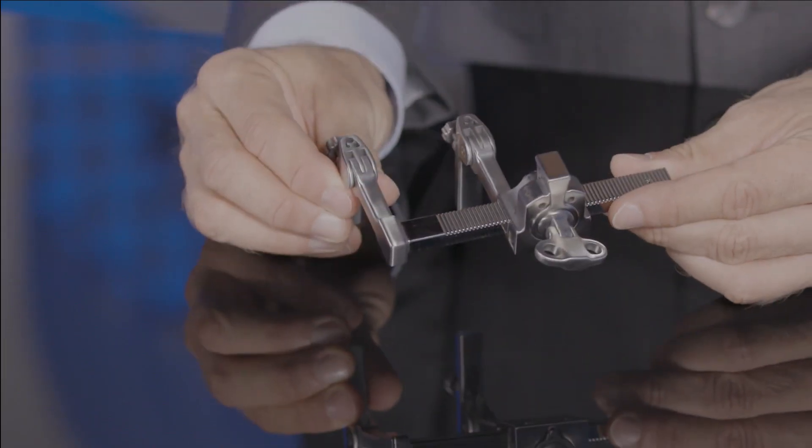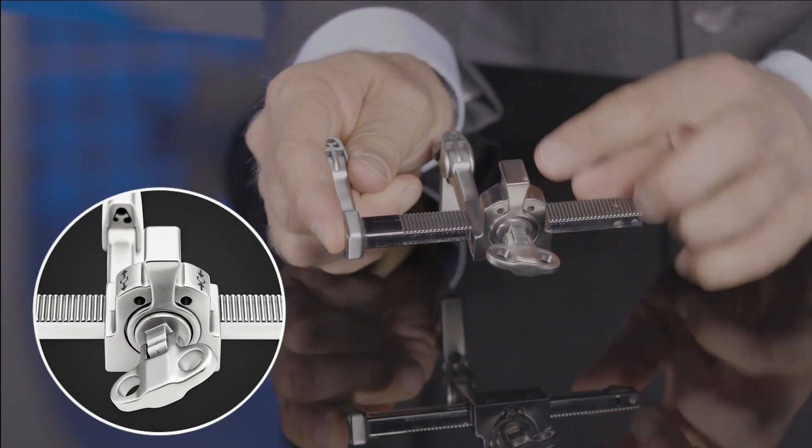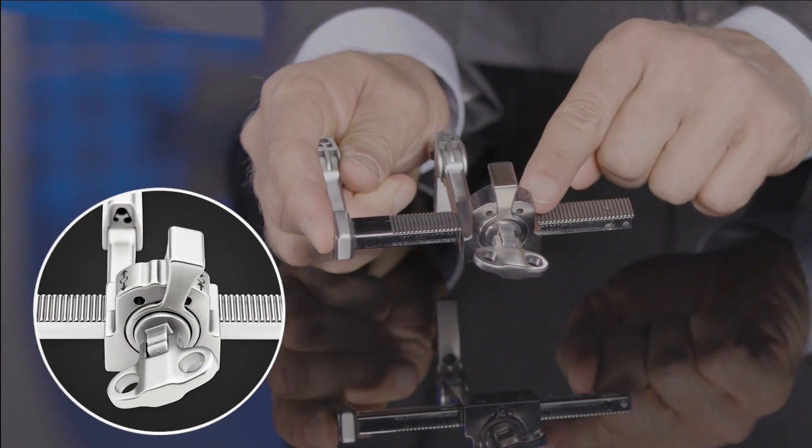The mini joint distractor has a rack and pinion design, and here we see it has three different positions: neutral, distractor, and compression.